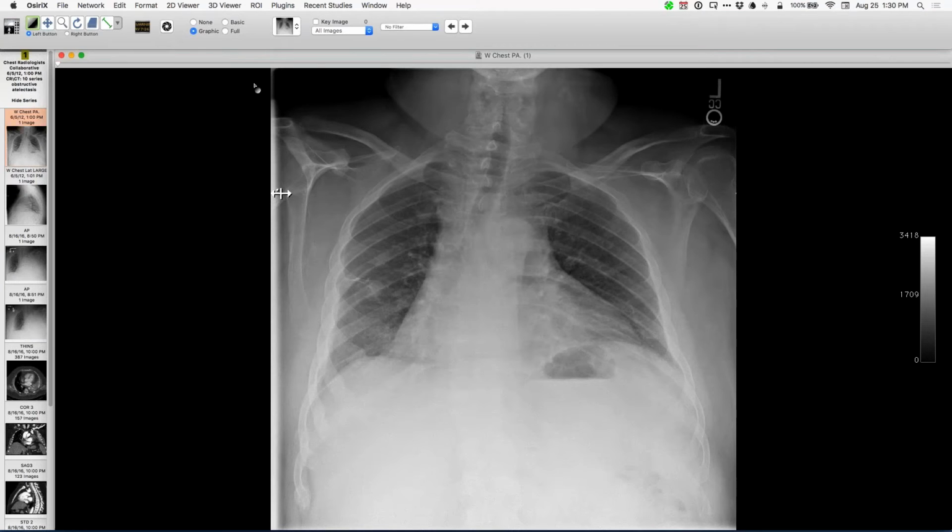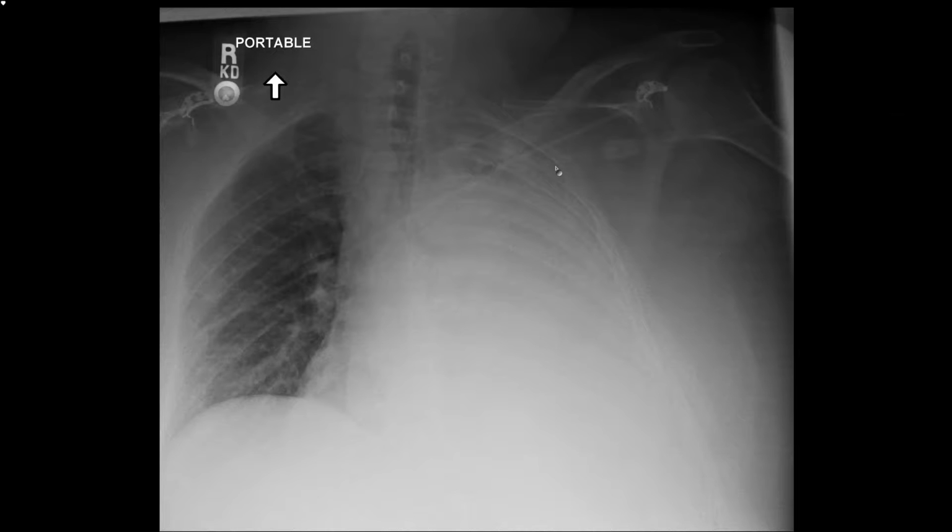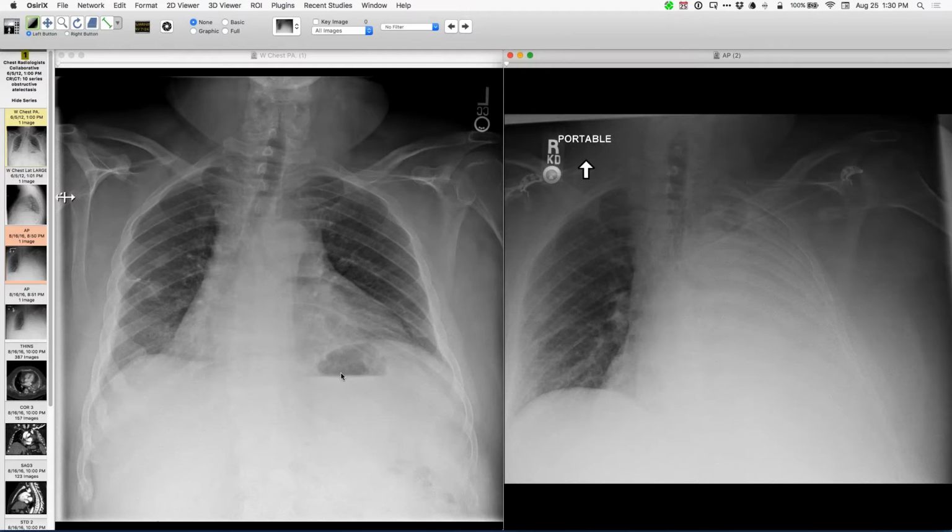This is kind of an interesting case, I'll show you the bronch in a moment, which you will like. So here is the person at time X when he wasn't as healthy as he was on the left side. So that's for comparison from before. It's a nice teaching case for an opaque hemithorax, trying to differentiate perhaps between pleural fluid, lung atelectasis, or perhaps a combination of the two. There's some aeration of the left upper lobe a little bit.